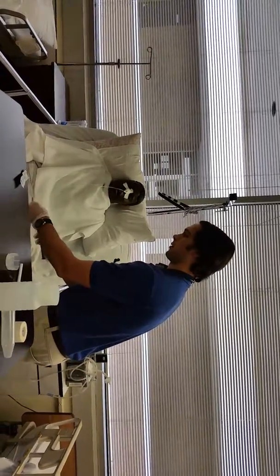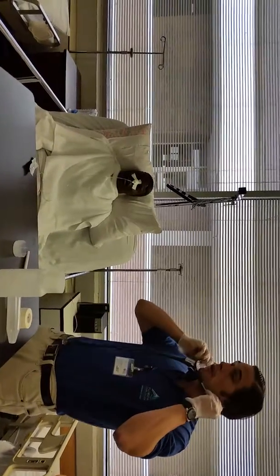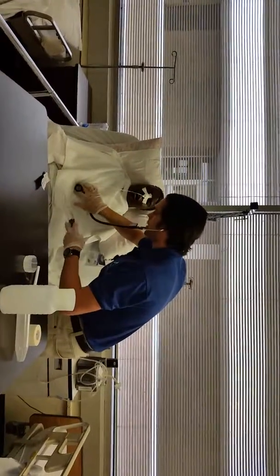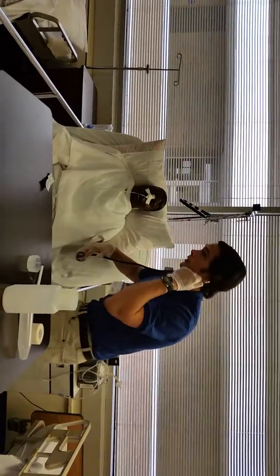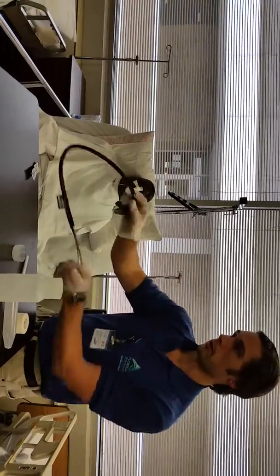That's our NG tube. And my stethoscope. And I'm going to listen in the epigastric area. Inject air and listen for a swooshing sound.